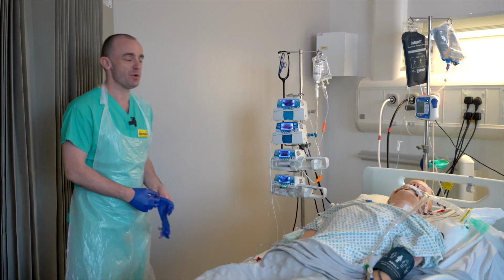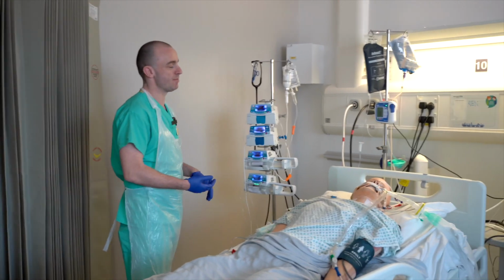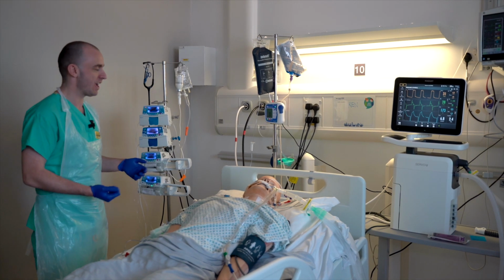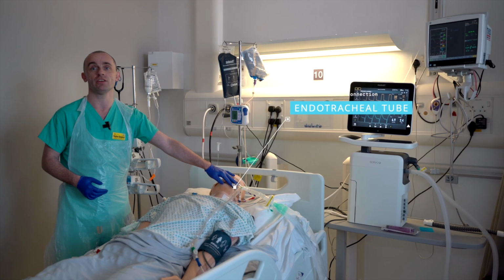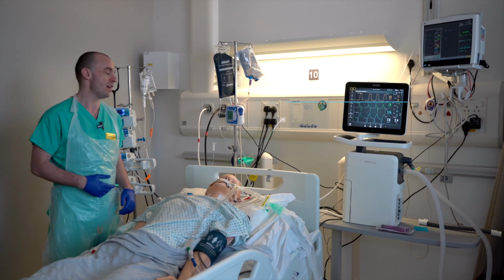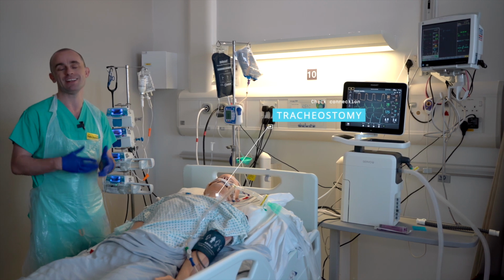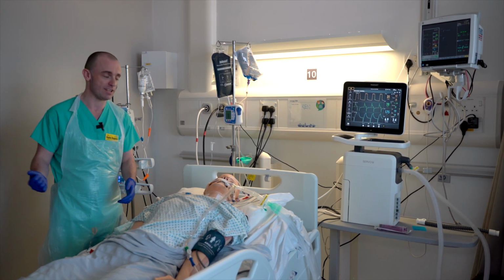So we're going to start off with talking through the respiratory system. With the respiratory system, I'm going to include assessment of the airway. With intensive care patients, you may find that patients are intubated. So here we have an endotracheal tube, which is placed in the mouth. They may have a tracheostomy, which again, we're not anticipating that you will be expected to manage in any great detail, or they may be spontaneously breathing.